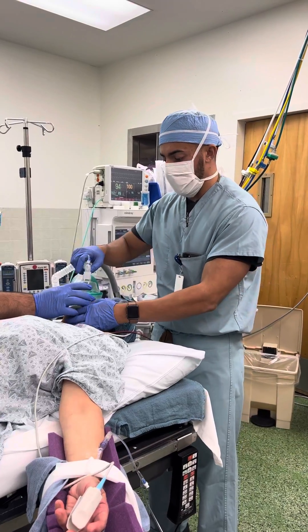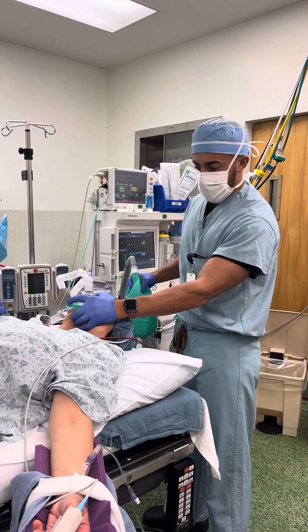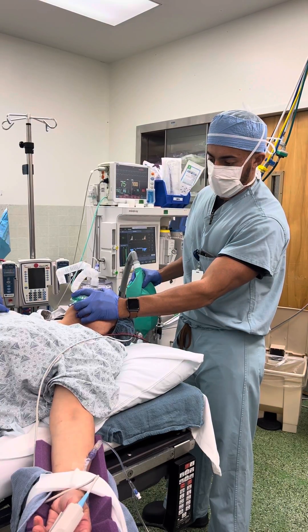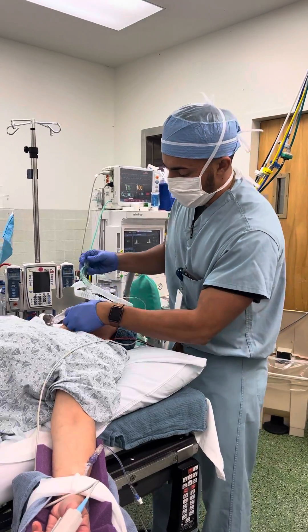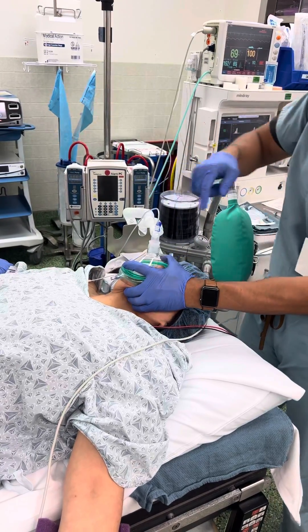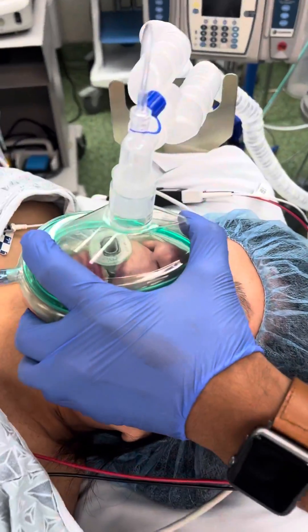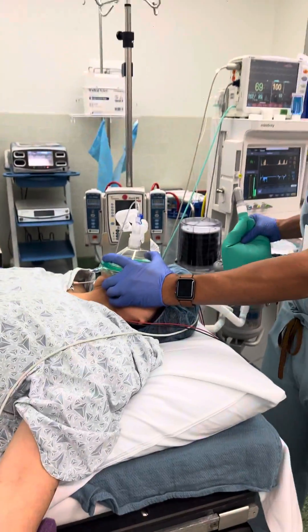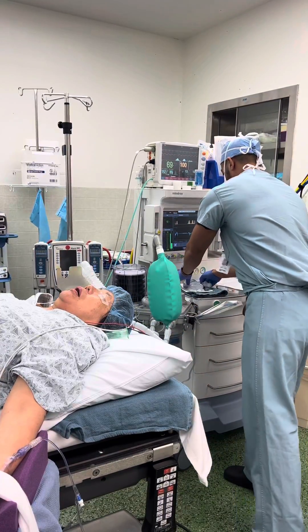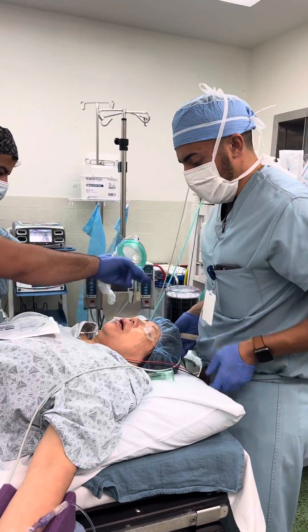I don't like to shove the LMA in right away. I actually like to give it a second or two, so I'll back her a little bit just to see some CO2. I'm not getting the best return on CO2, so I'm actually just going to drop a quick little oral airway in — super easy routine here. I want to see CO2. That's better. She's a pretty easy bag. I know it's kind of counterintuitive putting in an oral airway before an LMA, but it just helps give me peace of mind that the LMA should go in smooth and I should get some good ventilation with it.